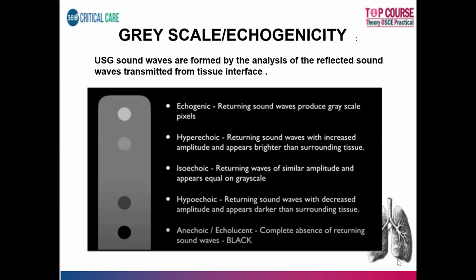So when we're talking about ultrasound, we're talking about lung ultrasound per se. How do we have to understand? Ultrasound is nothing but a pulse of sound energy, usually more than 20 kilohertz. So 20,000 hertz or above, any sound frequency in that range is called ultrasound. When ultrasound waves are pulsed across a tissue, the reflected sound which comes back to the probe, that is your piezoelectric crystals, causes image formation, and that will be processed by the transducer in the machine, and that will give you a pictorial depiction of whatever is underneath the probe.